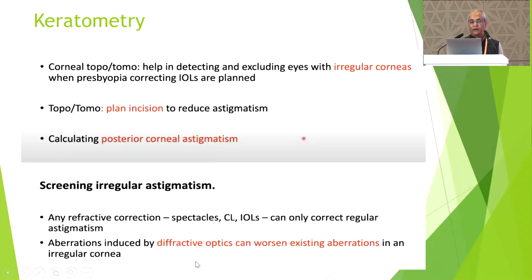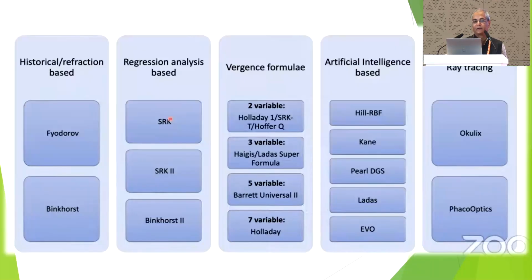The corneal irregularity is also very important. So if we have a Pentacam or similar imaging, we can check it. The trifocal lens will already have aberration, and if the cornea is already having aberration, it is going to compound it. So we have to be careful with that.